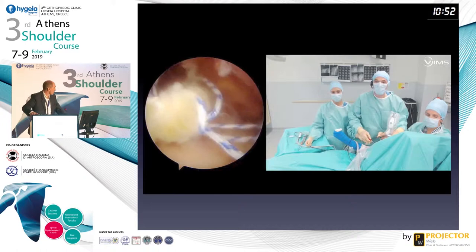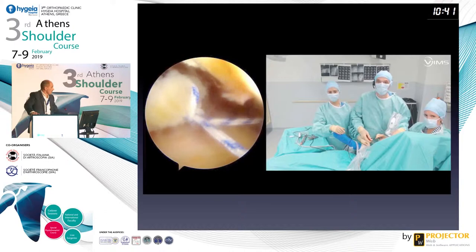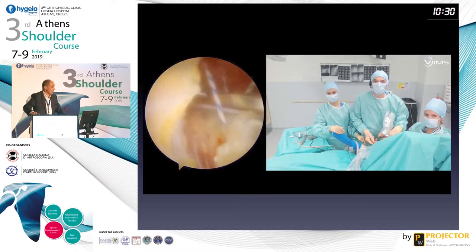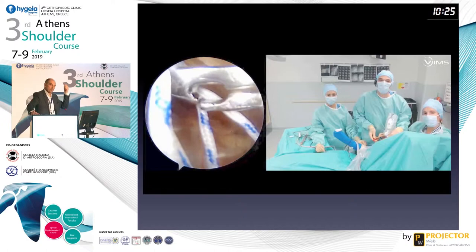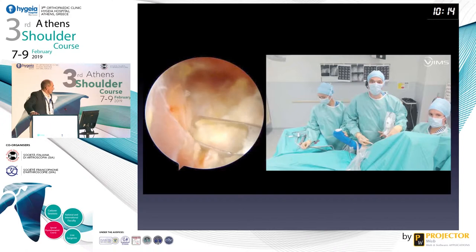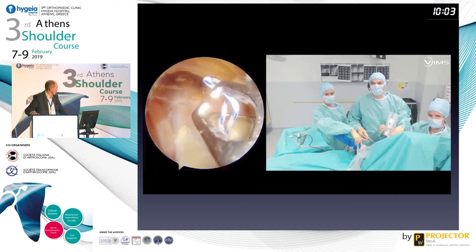You have to separate the lat dorsi from the teres major, and you have to go very slowly because it's really a thin tendon, and you have to be prudent, because you can damage it. Or if you miss this step, of course, when you make your transfer, you will rupture your tendon, and the game, unfortunately, will be over. So, last point. For this step, I decided to give you the native movie, because I insist on the fact that it is a very demanding step.